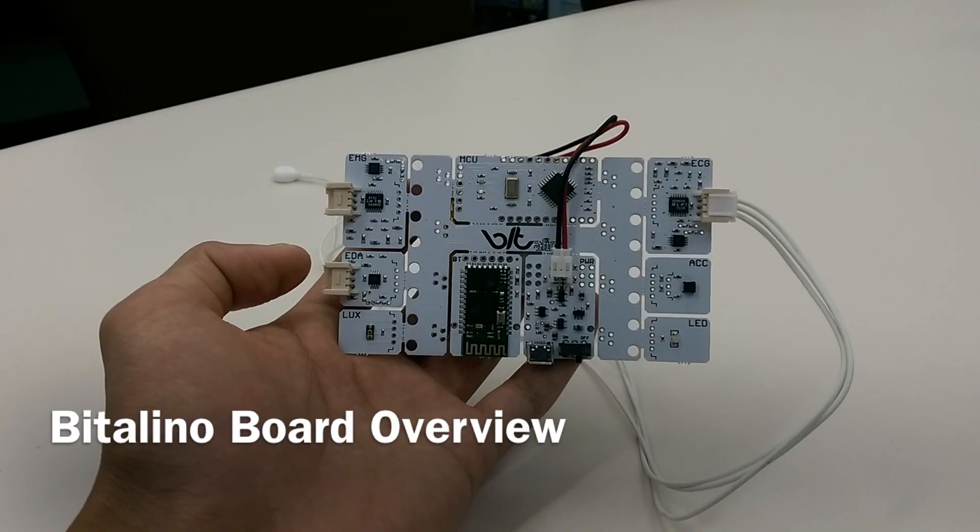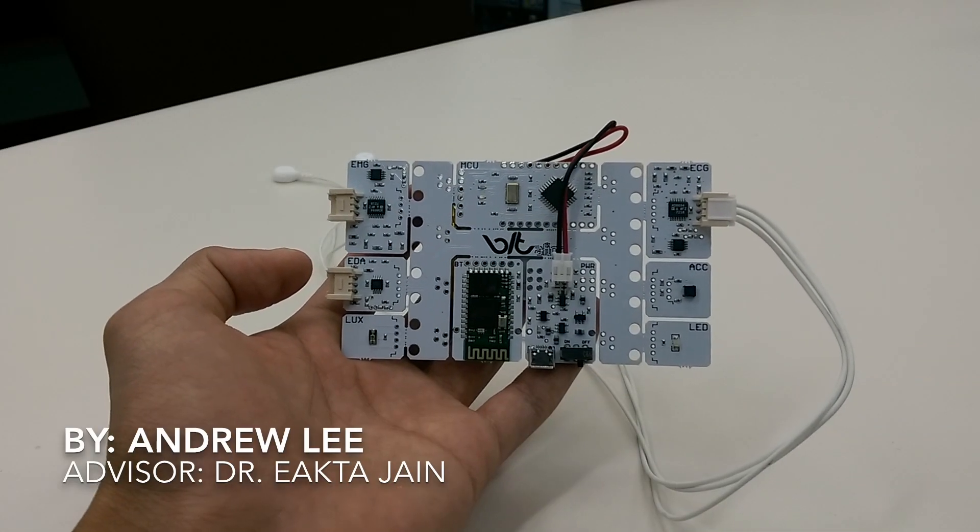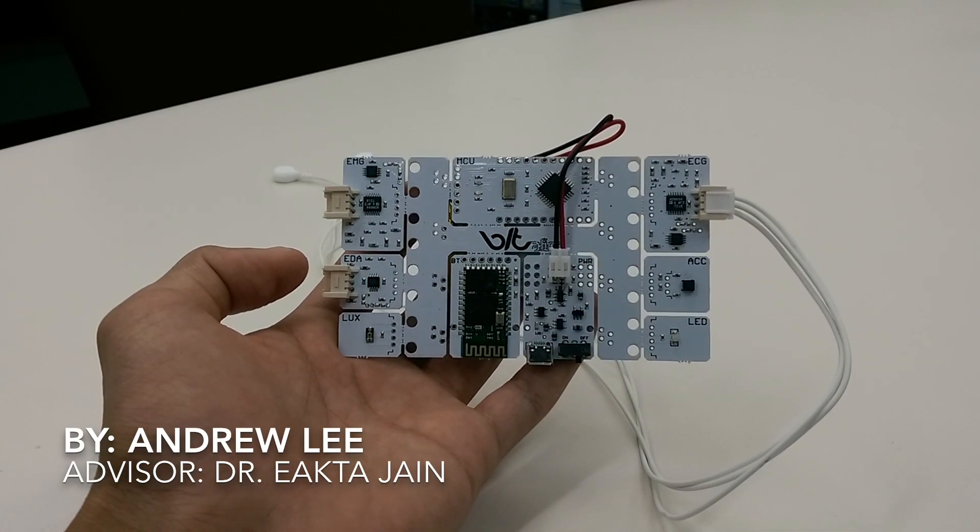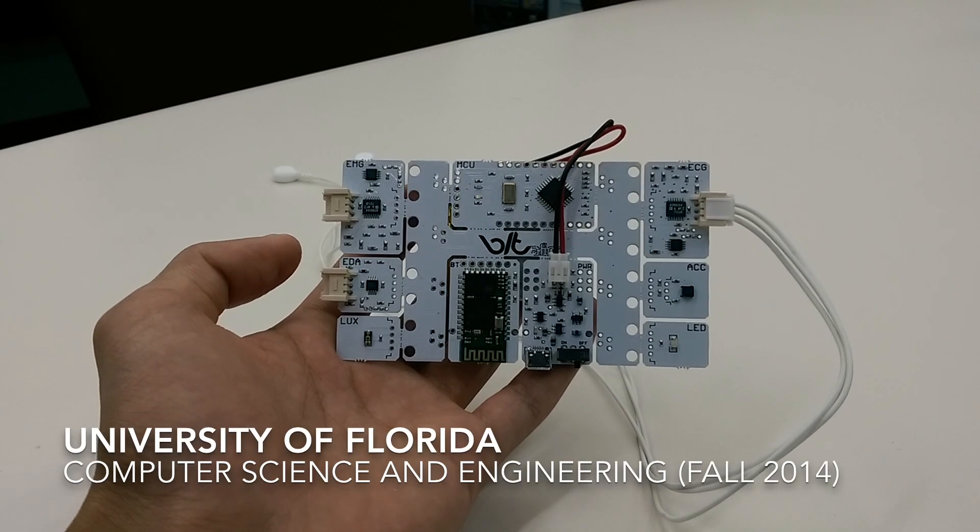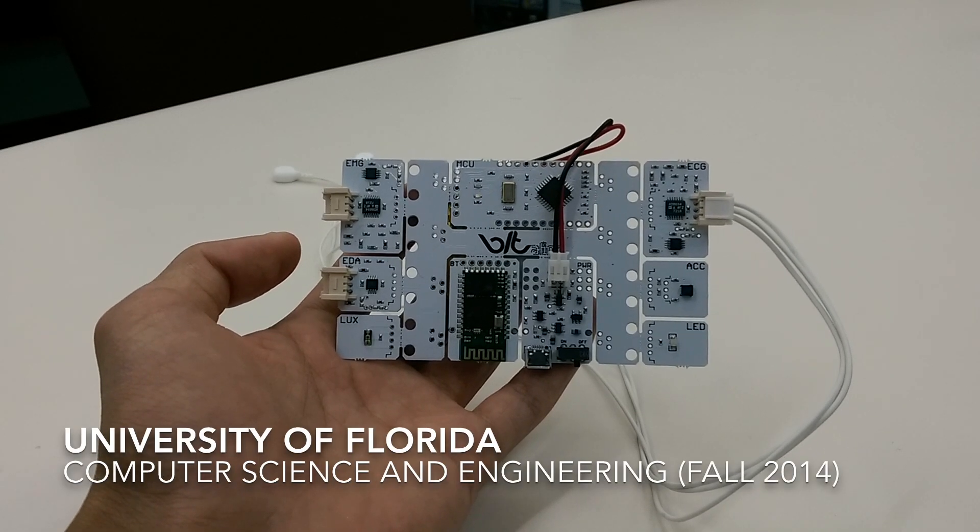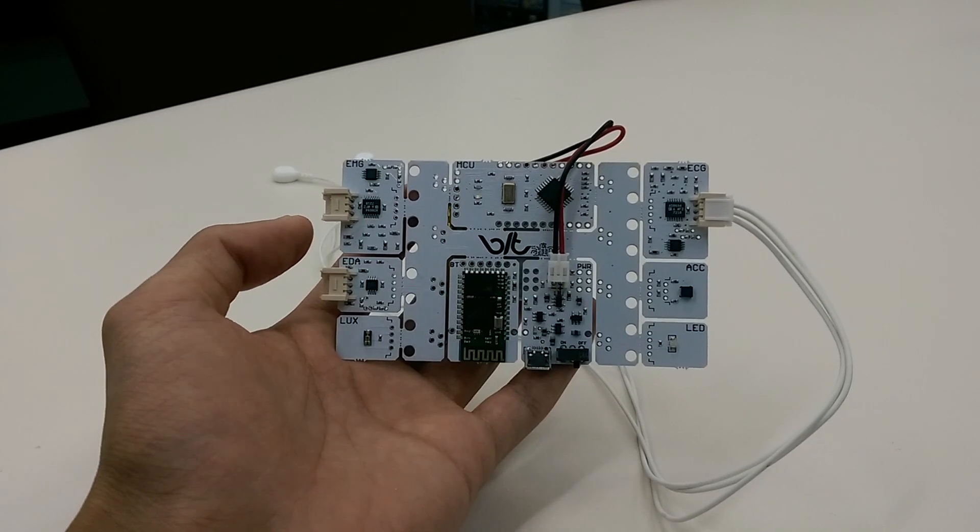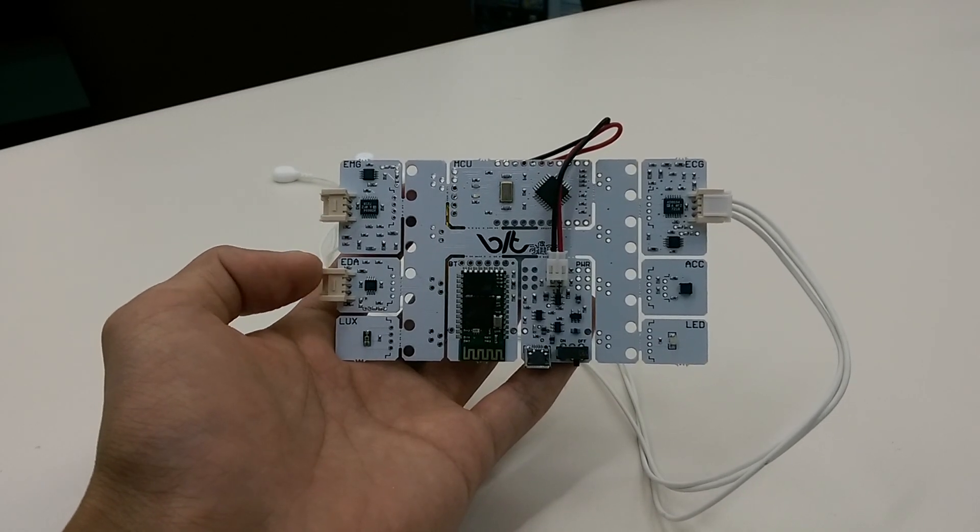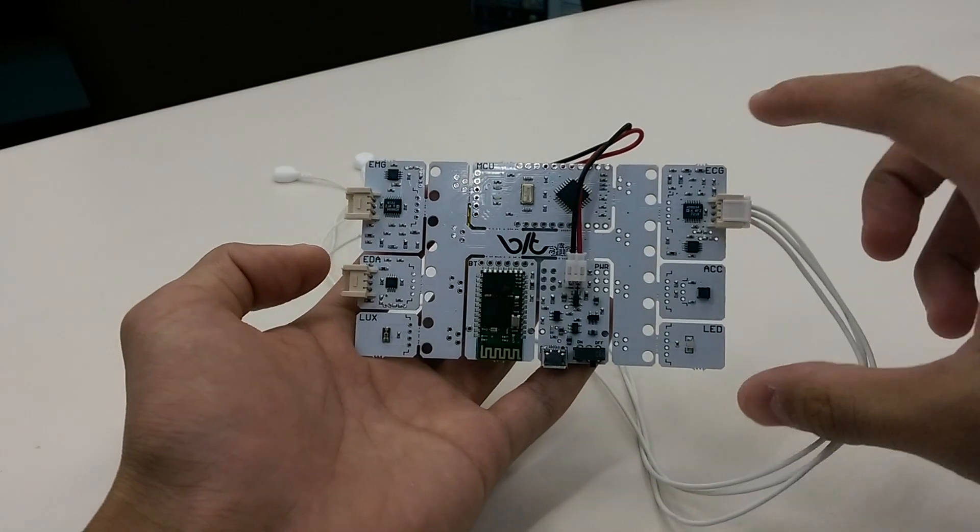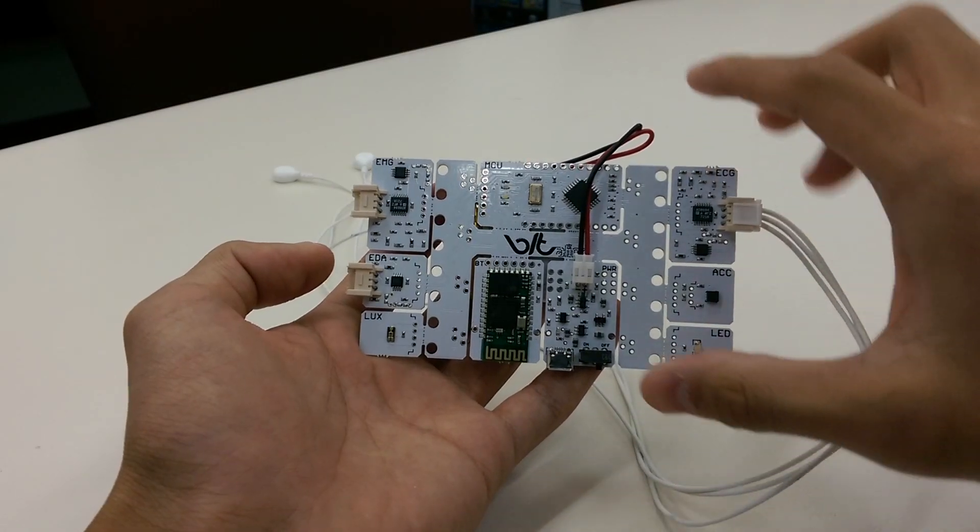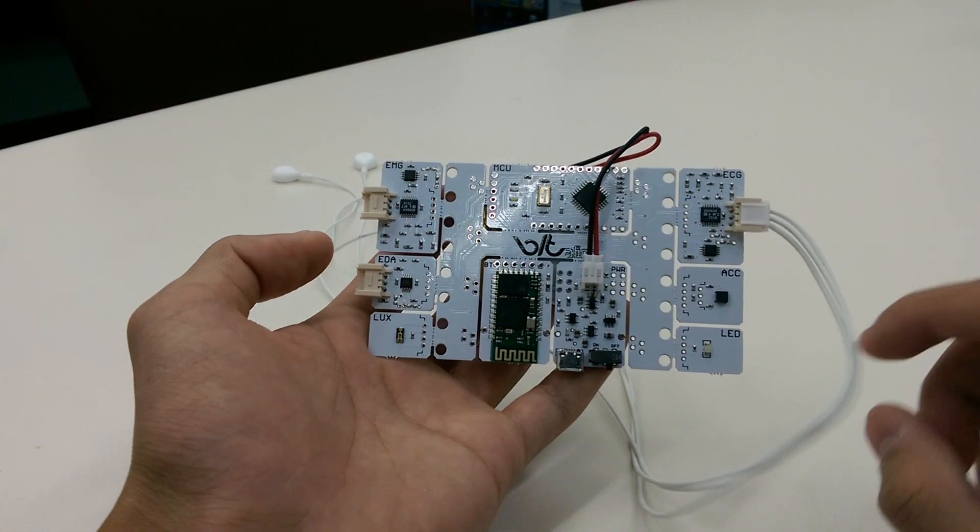Okay, so here we have the Bitilino board. It's a hardware toolkit designed to collect body signals, and this board specifically can collect three different body signals despite having six blocks right here.